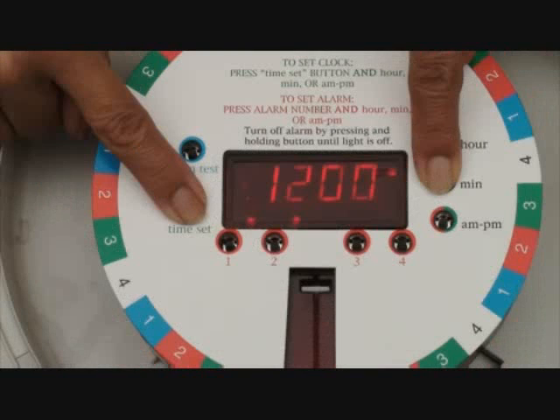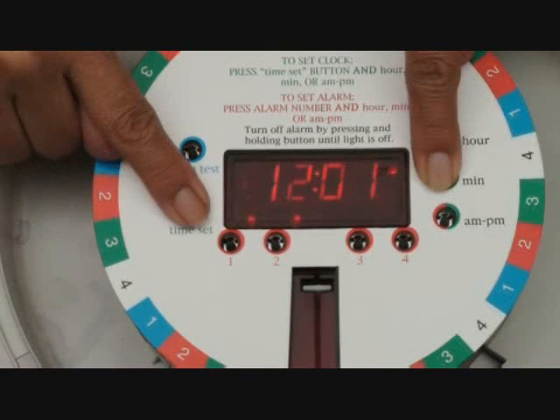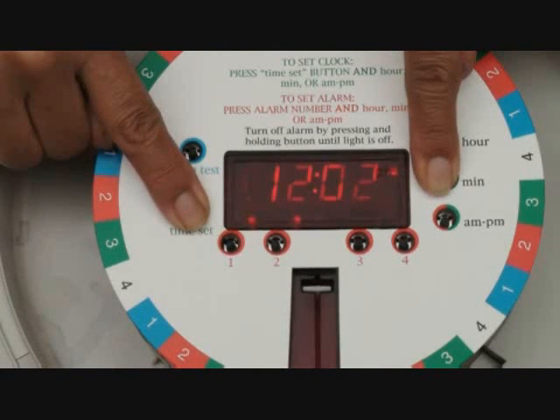Set the clock as you would a typical digital clock. Hold the time set button down and press the hour, minute, and AM/PM buttons to set the time of day.